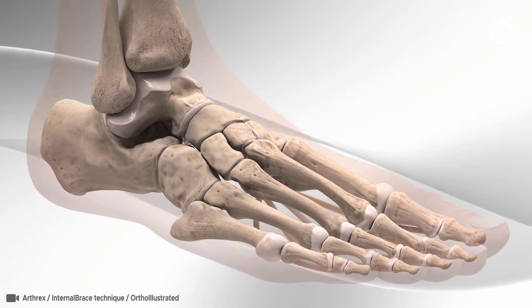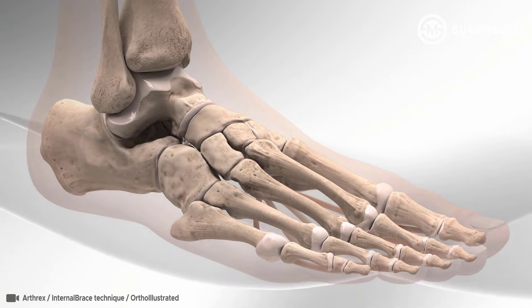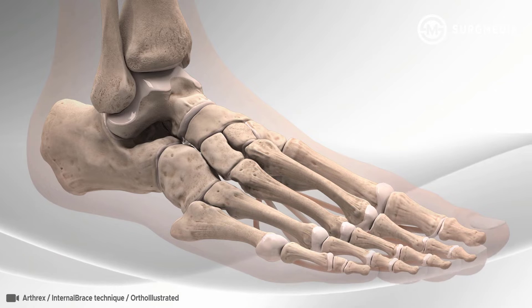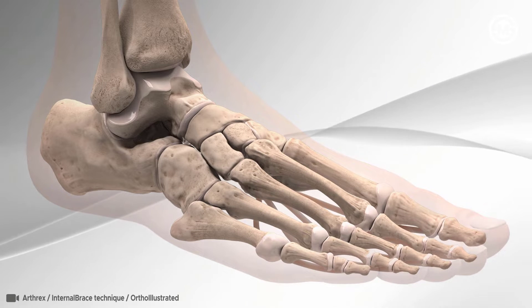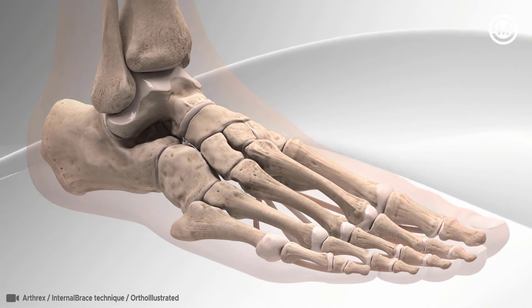The Spring Ligament Augmentation Repair is a surgery for people who have flat foot due to weakness or rupture of the spring ligament or posterior tibial tendon. The spring ligament is the connecting tissue located under the foot that connects the calcaneus and navicular bone. This ligament is often repaired in people that have a condition called flat foot.